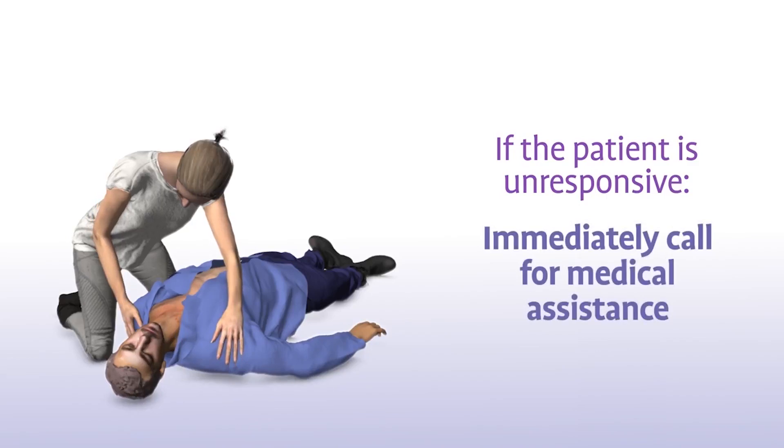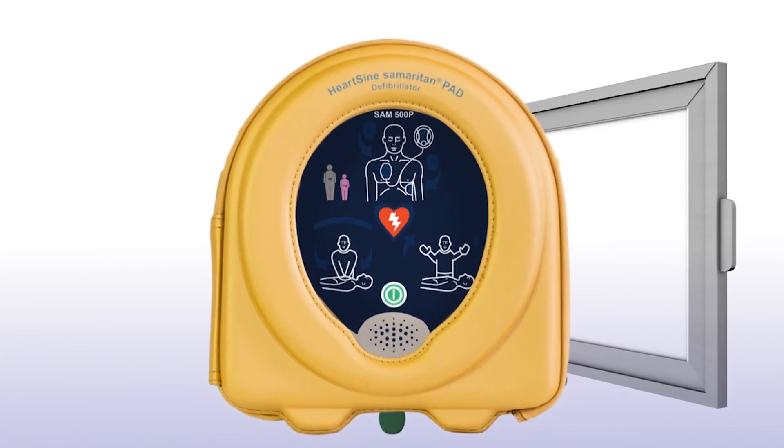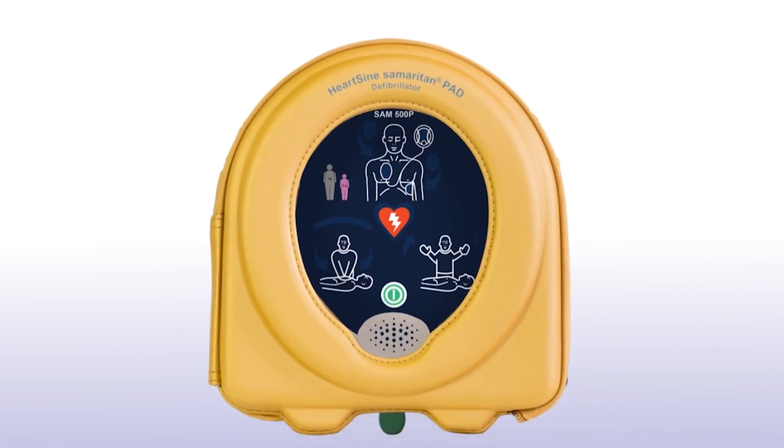If the patient is unresponsive, immediately call for medical assistance and get the Samaritan PAD as quickly as possible.